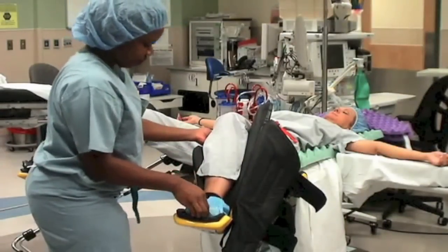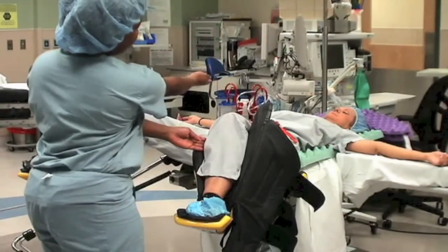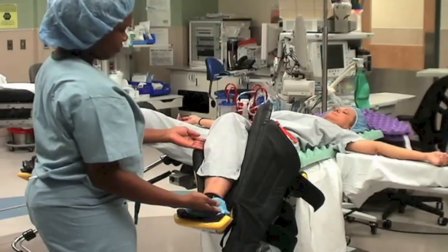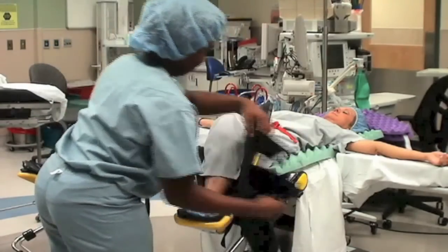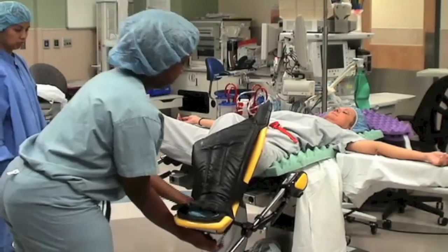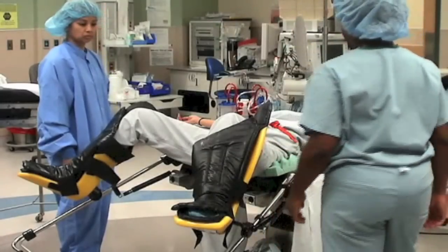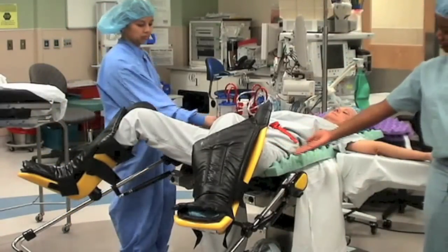Again, the positioning of the foot within the stirrup is confirmed, and the weight of the leg is placed on the heel and not on the patient's calf. The knee and foot are confirmed to align with the patient's contralateral shoulder. The patient's hips are confirmed to be flexed at 170 degrees.